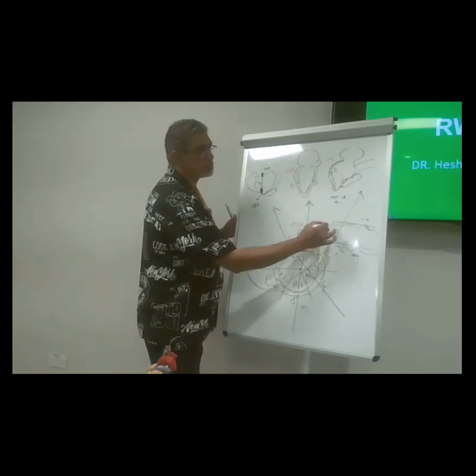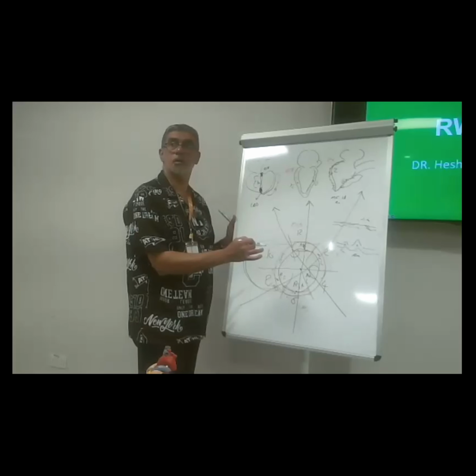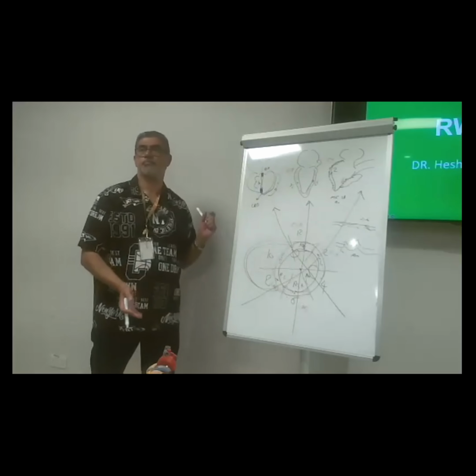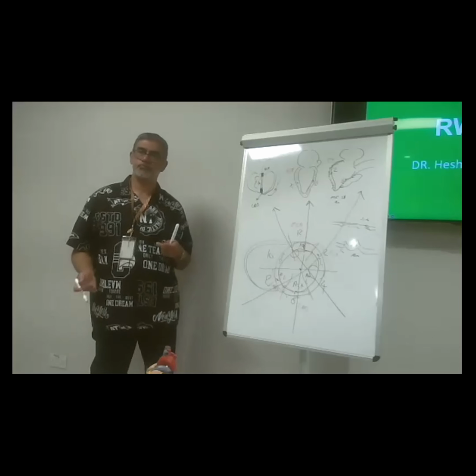If you see this wall, what happened here? You see any systole or diastole or something? This is an akinetic inferior wall. Due to what? RCA.